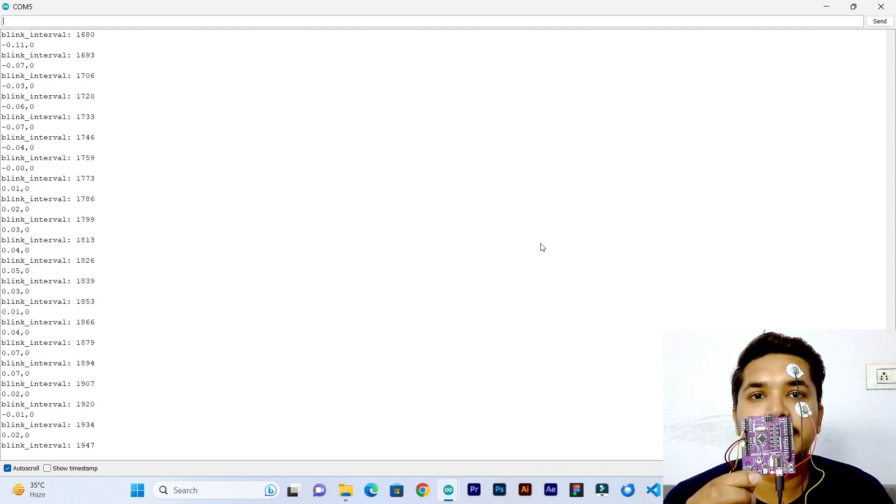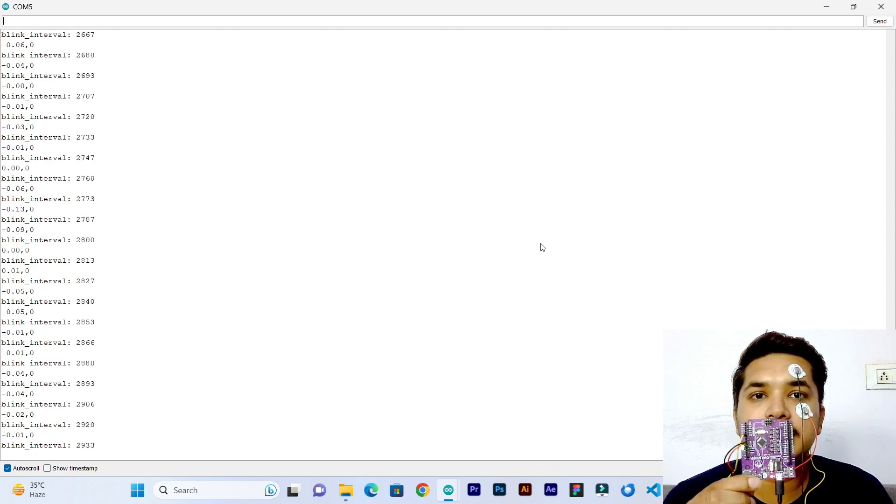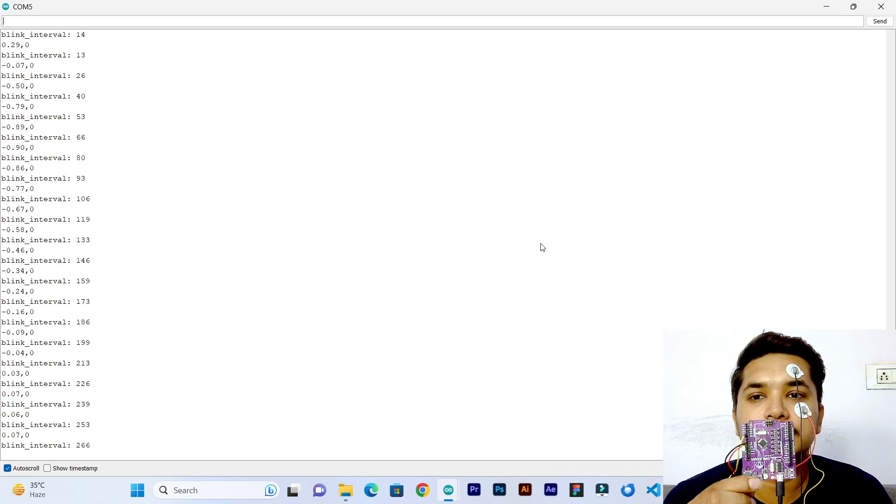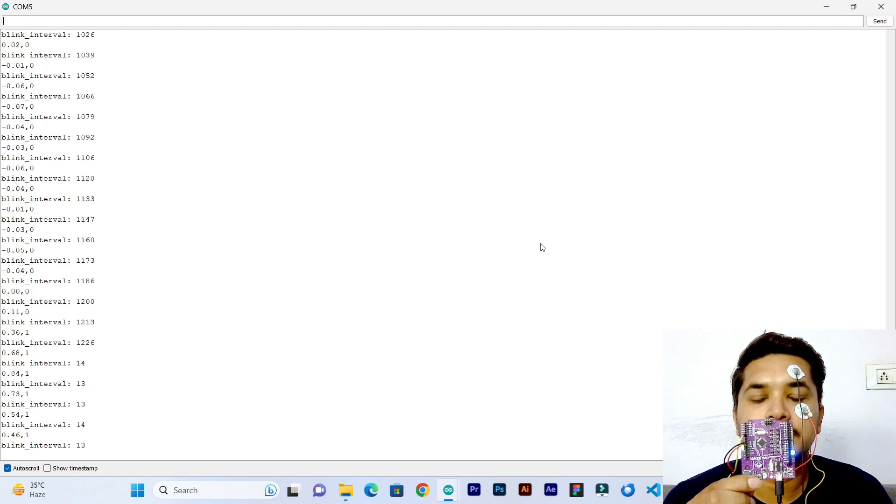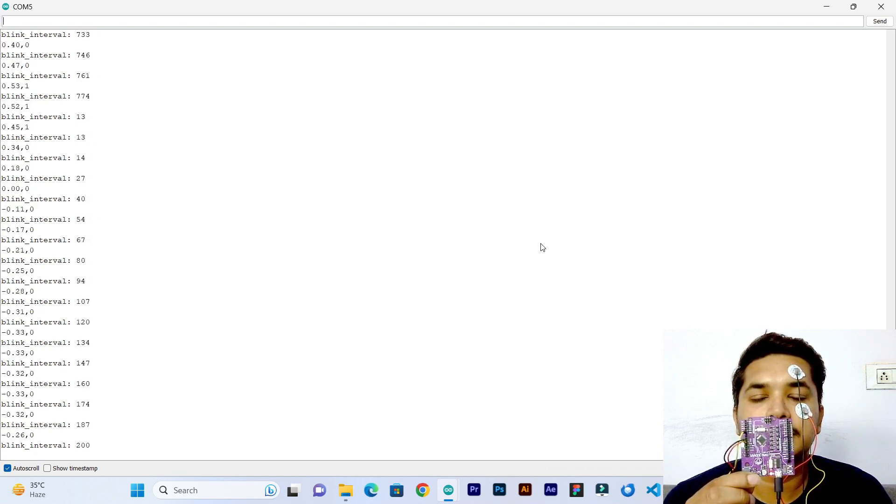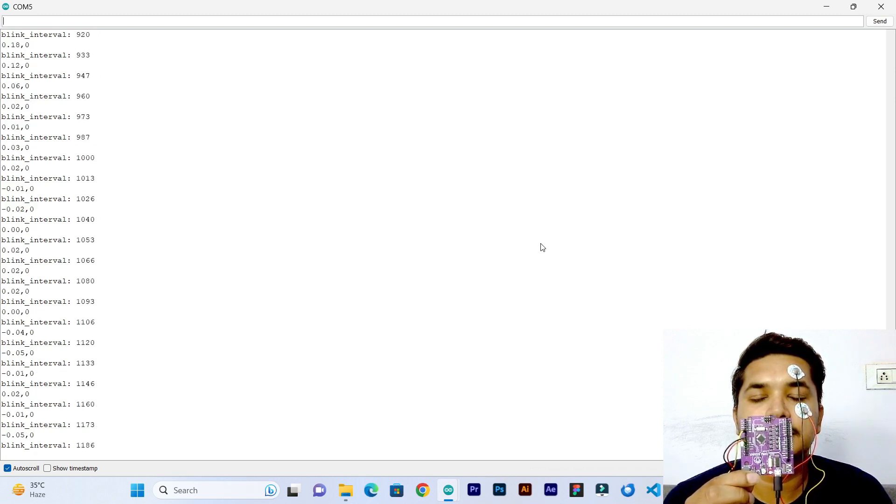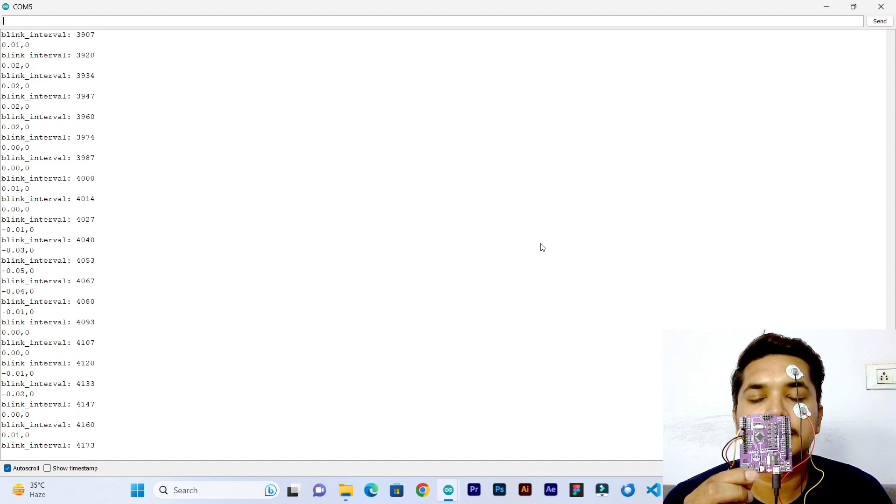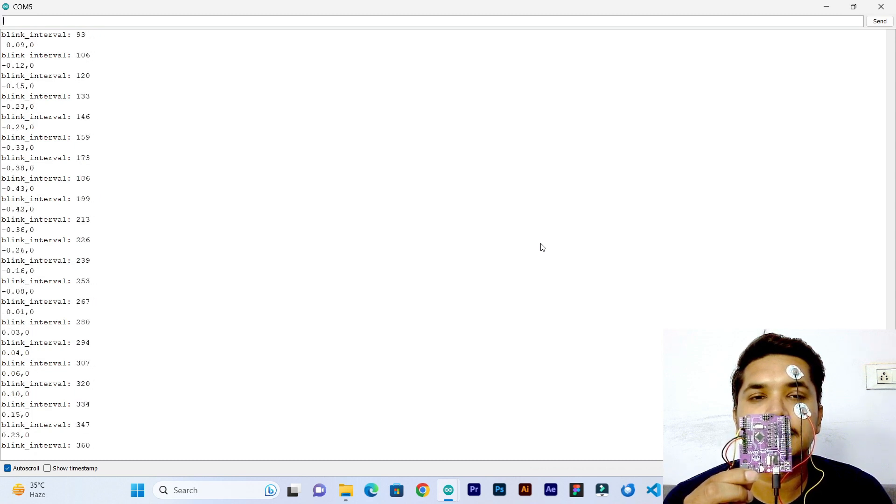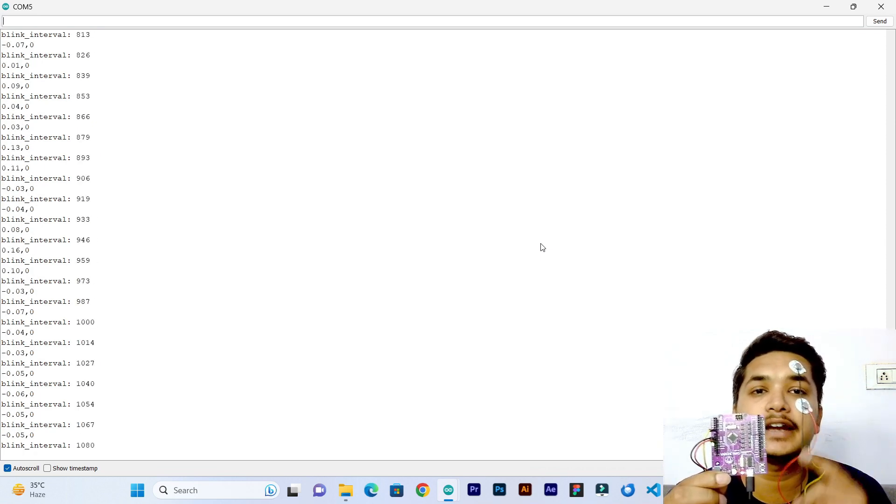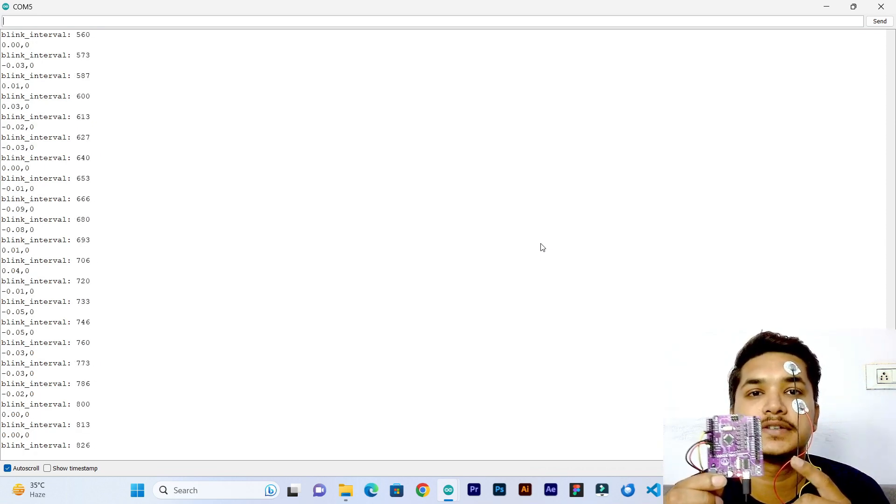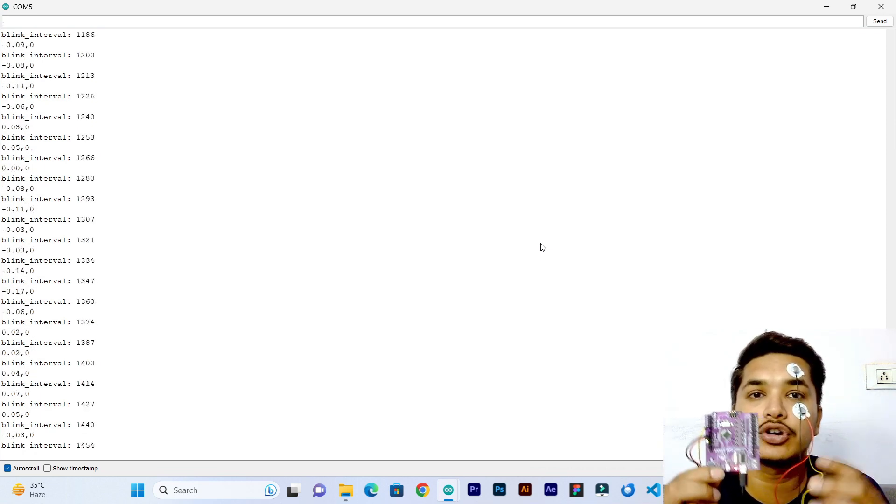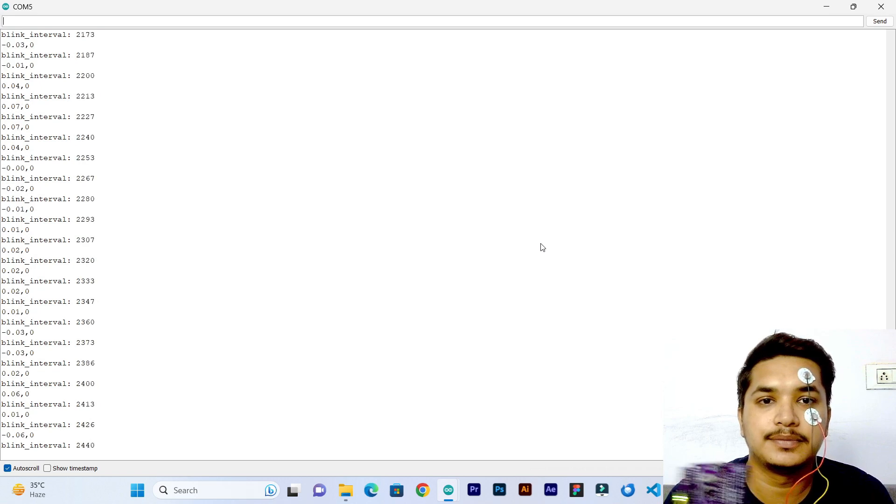Again, if I open my eyes it is starting from 0. So this is how you can detect the drowsiness. Let's see the demo more closely now.